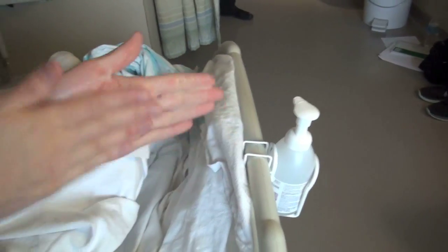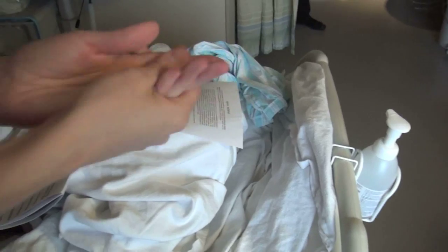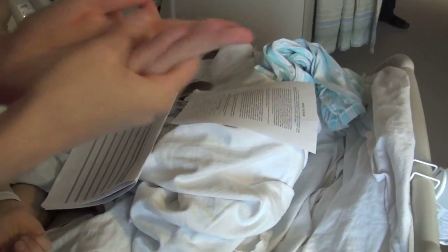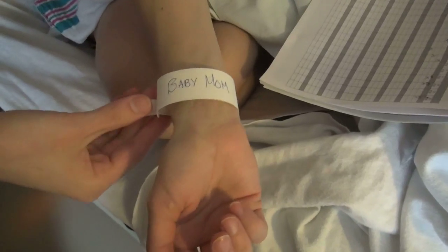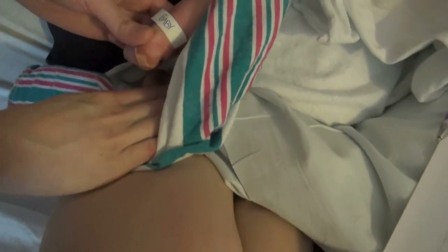Position the infant preferably with the infant's heart higher than the puncture site. Perform hand hygiene. Warm the foot with the parent's hands for approximately one to two minutes prior to the heel prick.